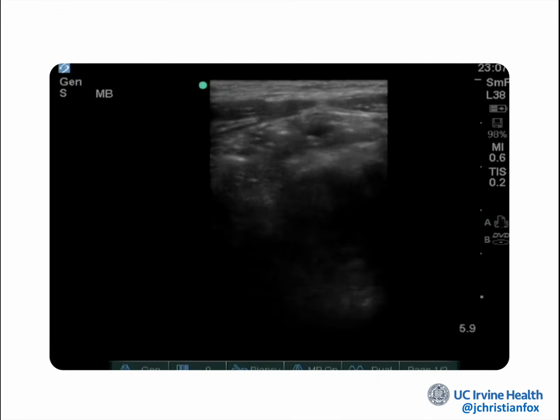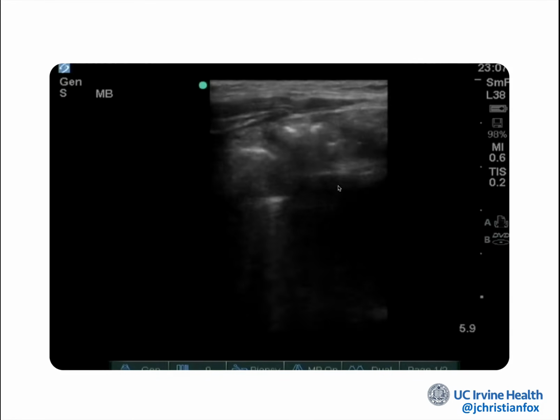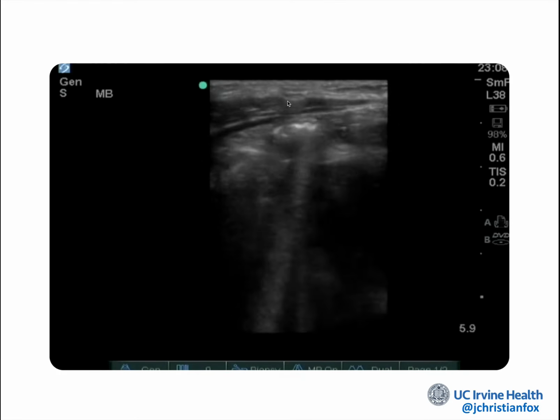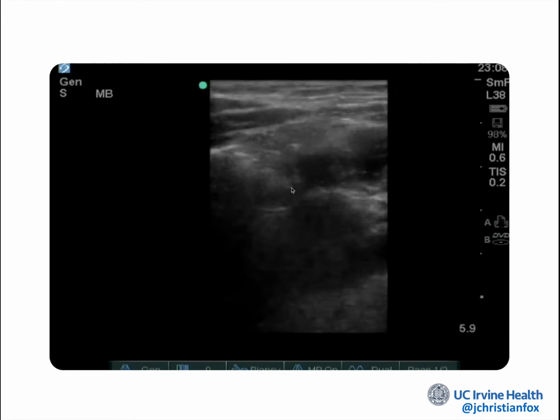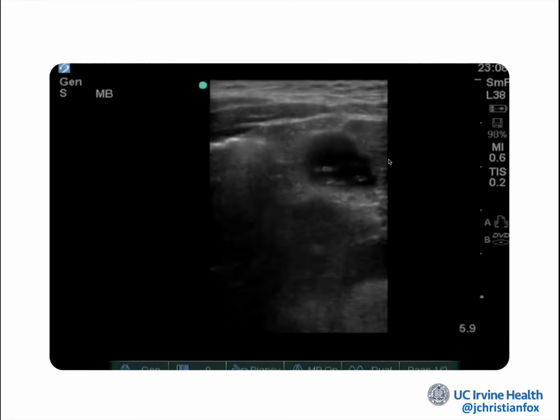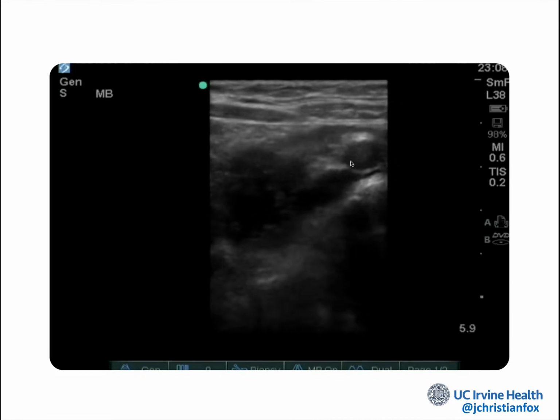Another example here, we see psoas muscle here. They're compressing so much that psoas is coming all the way to the top of the screen. And we're just marching through, and abdominal wall musculature is up here. We see some peristalsing loop of bowel here with some comet tail shadows, dirty shadows coming down. There's some fluid-filled loops of bowel over here. That's okay, we're just compressing. And, you know, at least so far, I don't see any appendicitis on this screen at all.